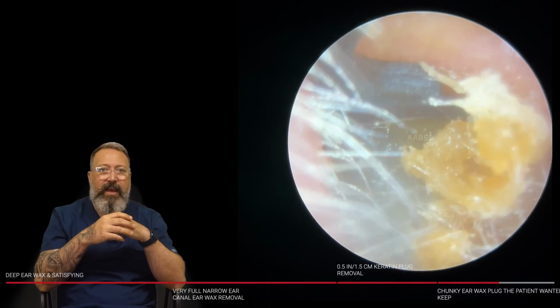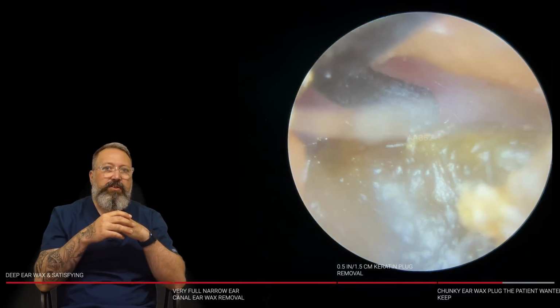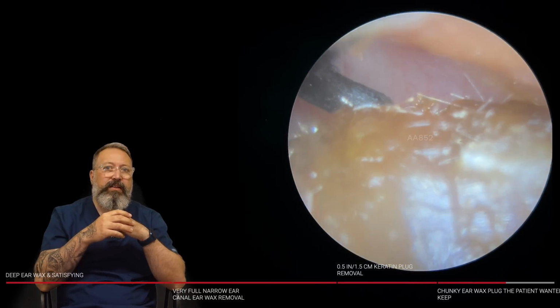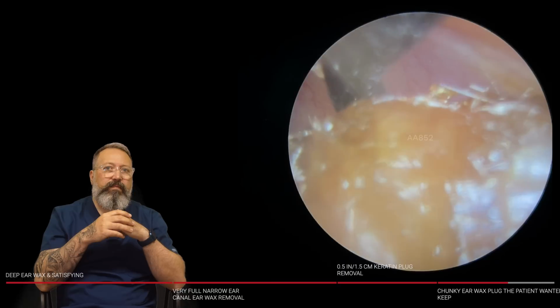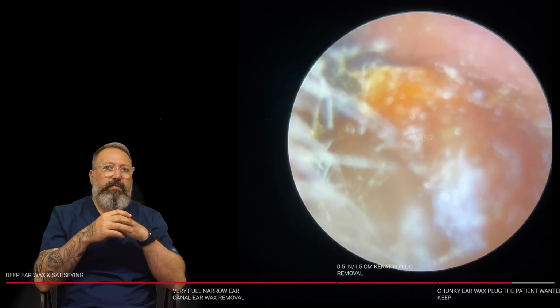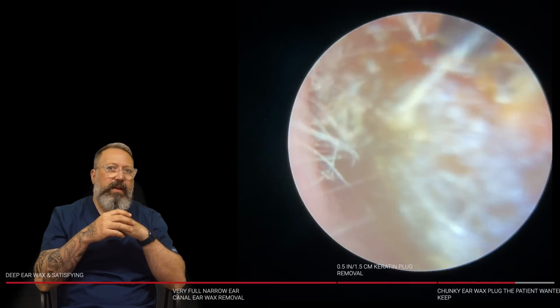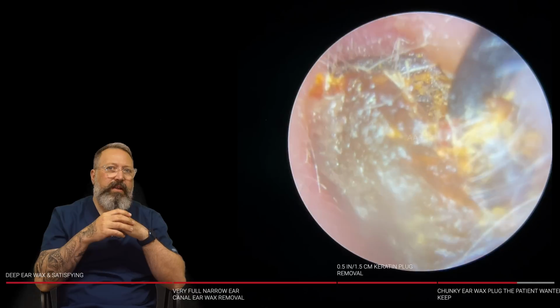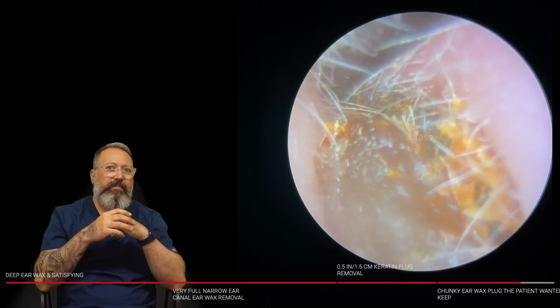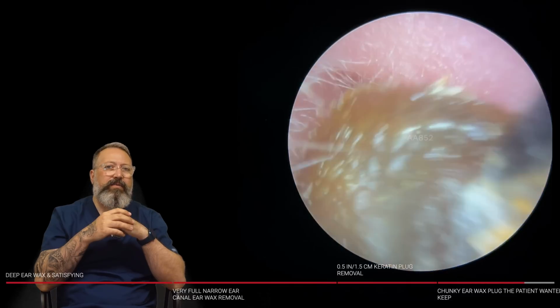So St. Bart's hook coming in again. Perfect for this type of wax. It's rock solid. There's a gap at the top. So I'm just going to pull this forward slightly. There you go. And then it allows me to get safely behind the wax then. There we go. Out that comes. Just pulling forwards to see if we can get a grip behind it. And out that's coming. Oh, nearly there. A little bit more. There you go, out that comes.